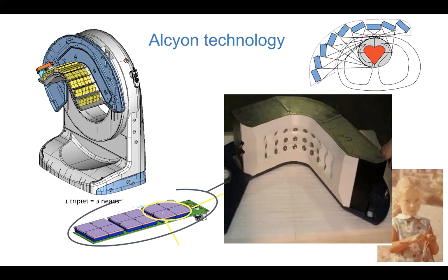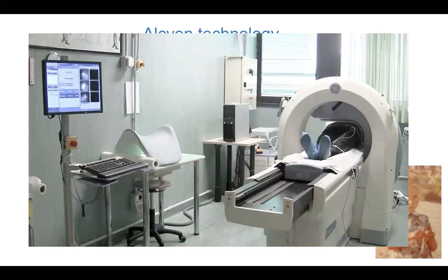This kind of central spatial resolution documented a dramatic enhancement in image quality, mainly because of a lower proportion of scattered photons within the acquisition energy windows. And what about the image acquisitions? Patients are usually imaged in the supine position with arms placed over their head without any detector or collimator motion. In some cases, you can obtain very good quality scans also in the prone position, as previously demonstrated in the literature.